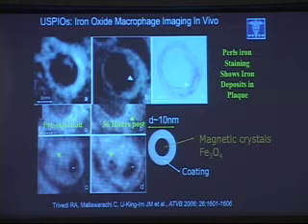I will now talk about another flavor of MRI, which is the USPIO. Just to say one word about it, this technique necessitates the use of a different contrast. Instead of using gadolinium as a metal, we use iron that has a certain coating. The size matters a lot in this case in terms of the pharmacokinetics. So there are little details in there.